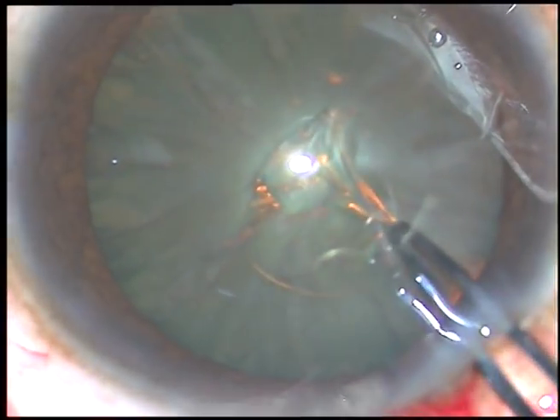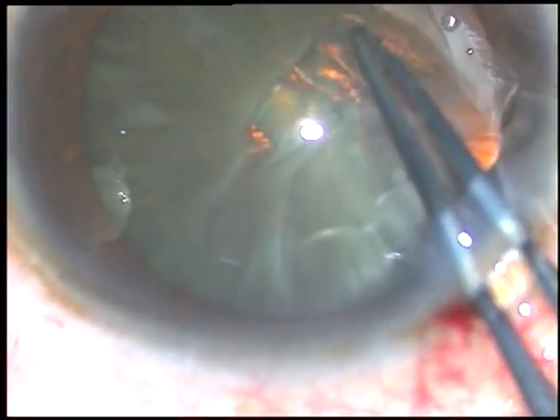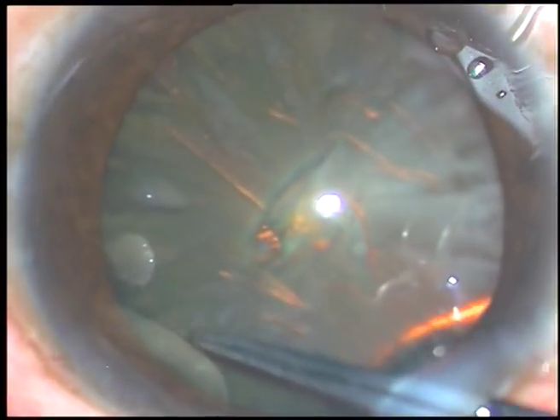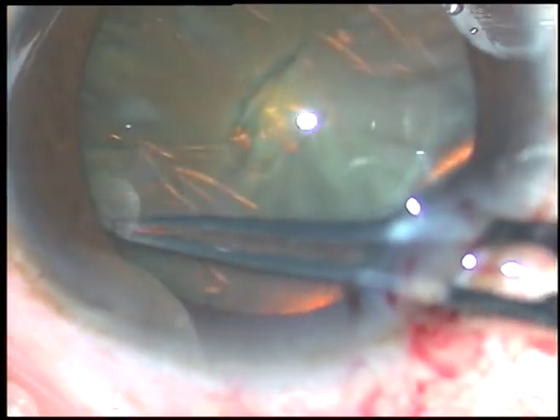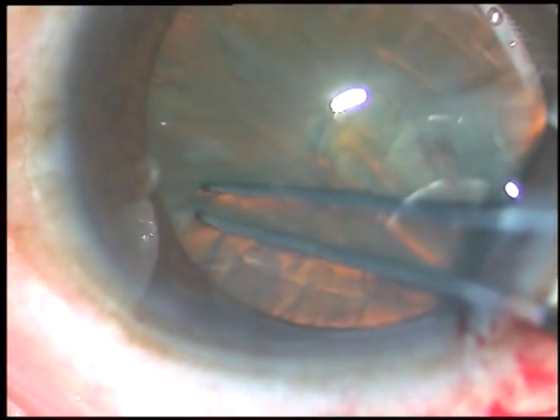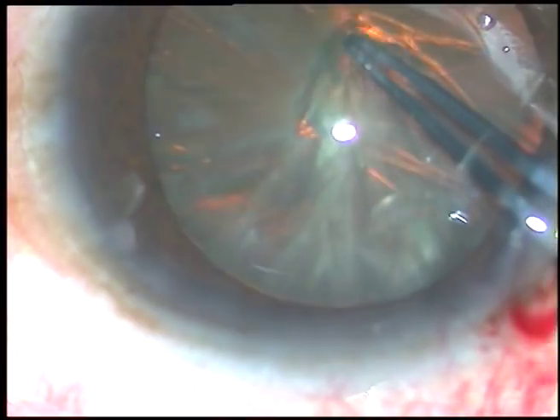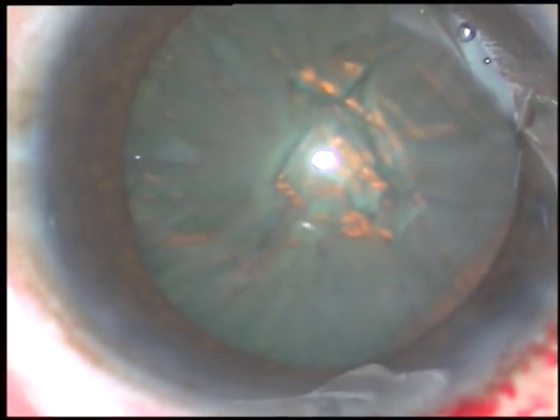Whenever I plan the lens tilt technique, I do a large rhexis. A Utrata forceps is being used to perform this rhexis. The rhexis tended to go to the periphery and I retrieved it successfully. It has been a large rhexis.